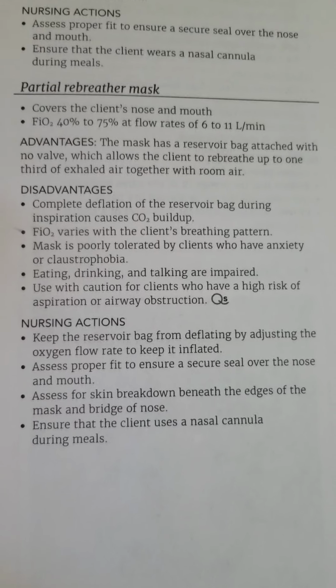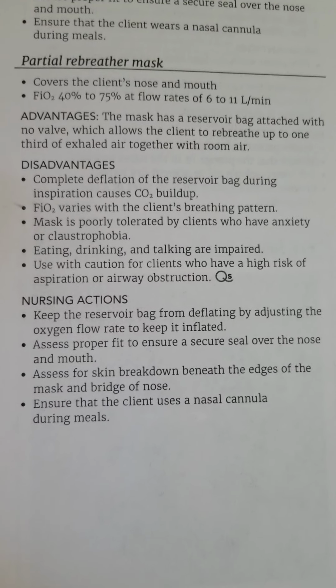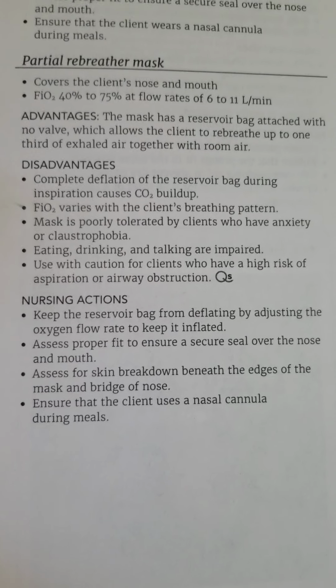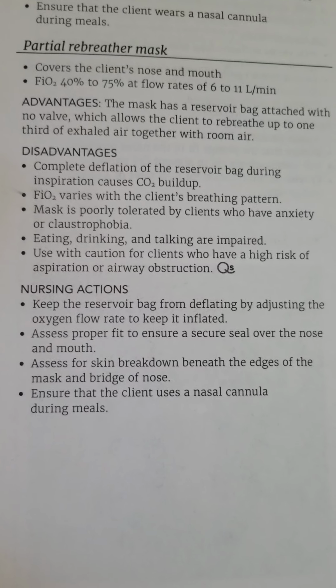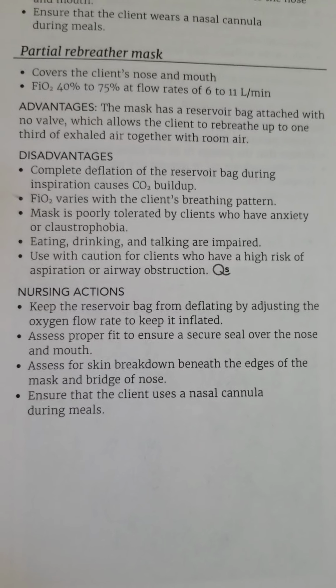Nursing actions would be to keep the reservoir bag from deflating by adjusting the oxygen flow rate to keep it inflated. Assess proper fit to ensure a secure seal over the nose and mouth. Assess for skin breakdown beneath the edges of the mask and bridge of the nose. Ensure that the client uses a nasal cannula during meals.